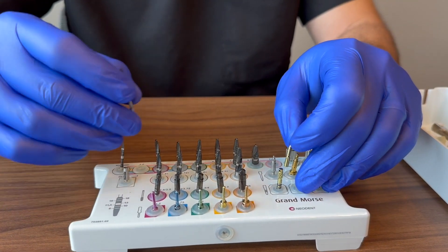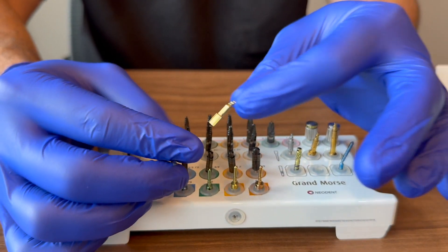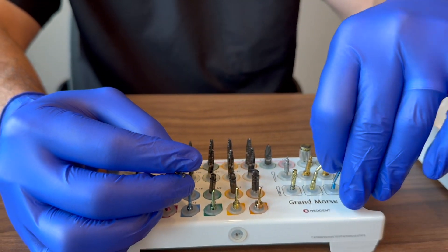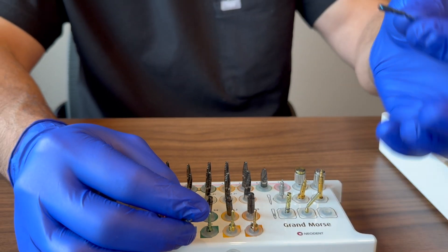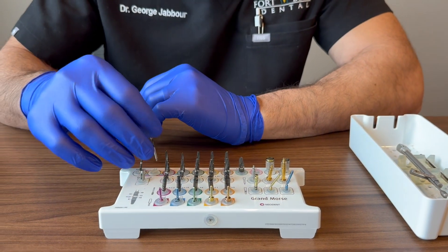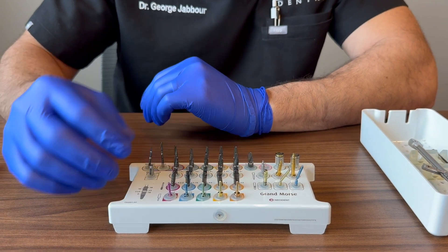There are also angle pins in the kit. After doing your 2-millimeter twist drill, you can insert an angle pin to assess whether you'll need a 30-degree or 17-degree custom abutment. Again, generally not used very often.